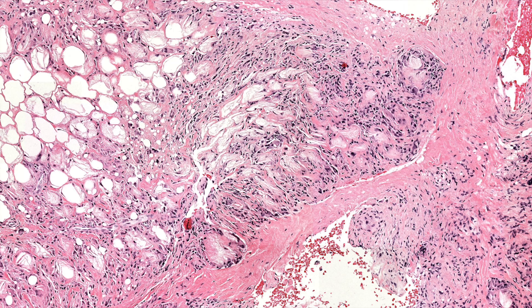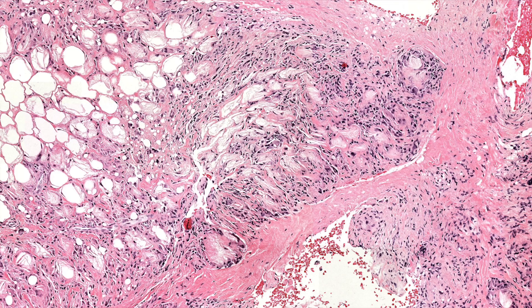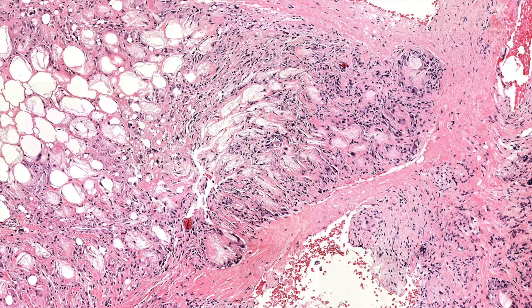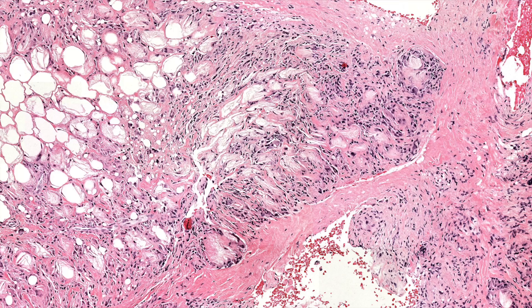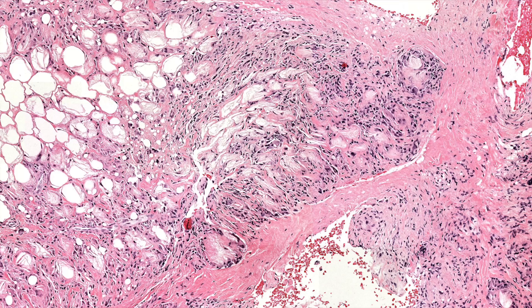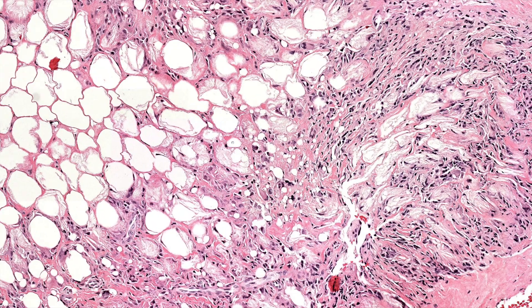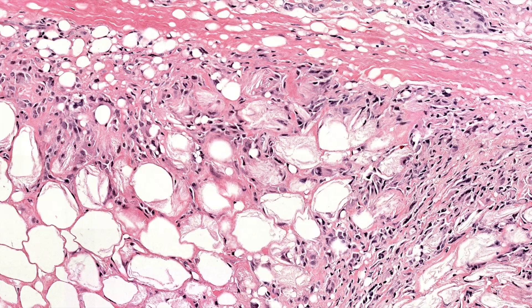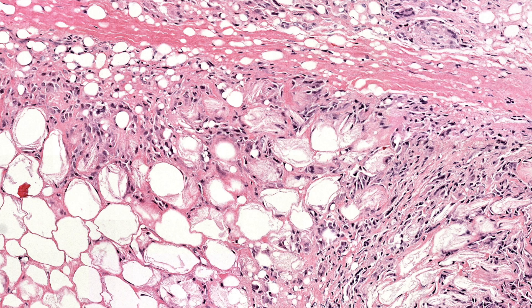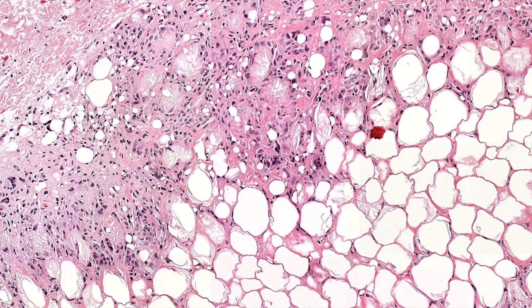I've got an example on KIKO — look up angioinvasive fungus. I had a dramatic case of angioinvasive fungus in an immunocompromised baby with both Aspergillus and Rhizopus invading vessels and necrosing tissue. In the necrotic fat, that same pattern of radial spike-like cleared-out crystals with a pink frilly background was present — so you can see this in other types of fat necrosis in young babies too.